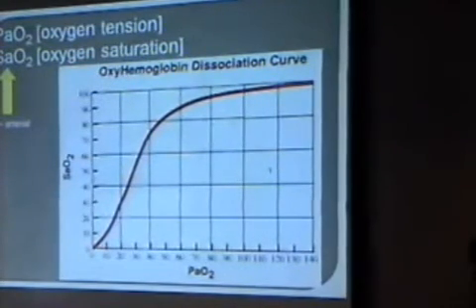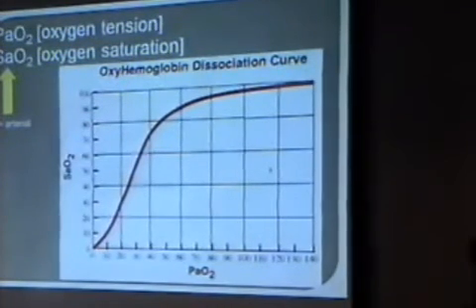So as you can see from here, 97, 98 saturation is a flat line. So if you have a baby, you're giving him oxygen in your unit and his saturation is 99, 100. What is his PaO2? Somewhere between 90 to 650. Is this what you want? Is this good for the baby? No. High PaO2 will cause eye problems, it will cause blindness, cause lung damage.